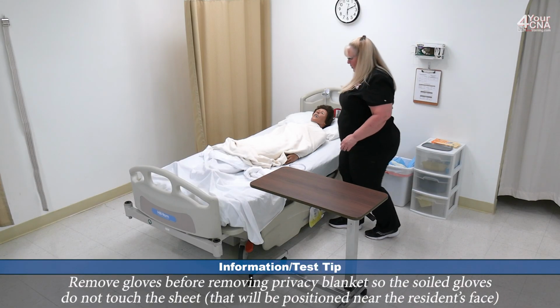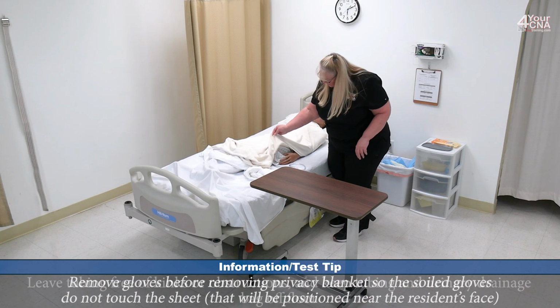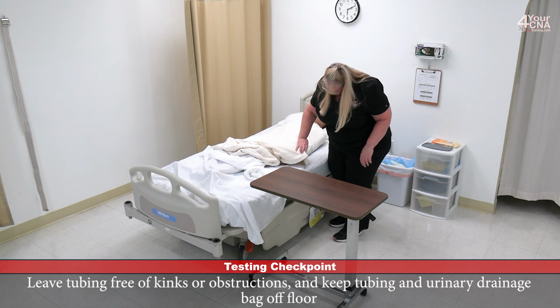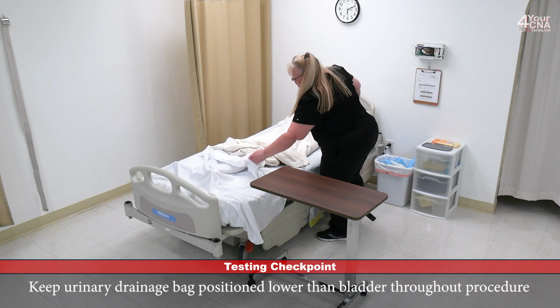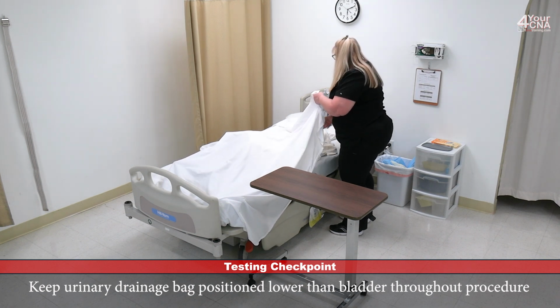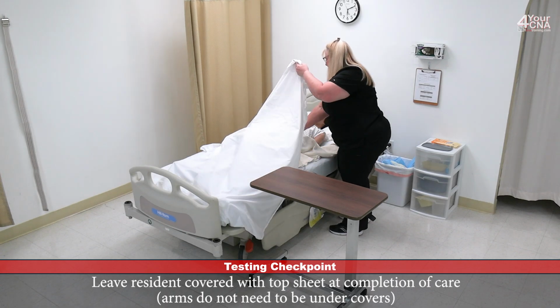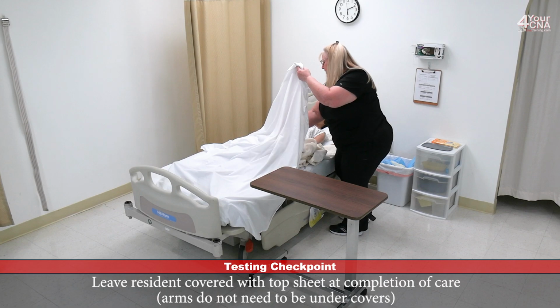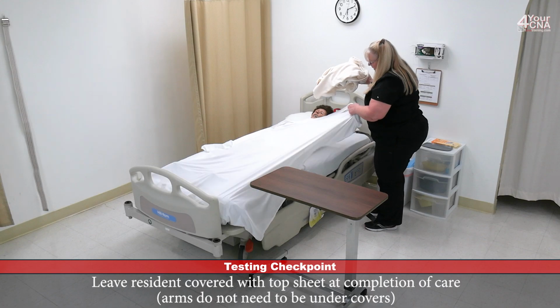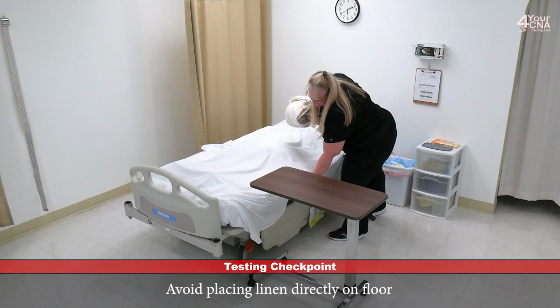Okay, Ms. Jones, I'm going to remove your privacy blanket now. I want to check your tubing real quick just to make sure that it's not kinked and you're not lying on it. So it looks good. It's not near the floor. So I'll pull the sheet up over the privacy blanket. This ensures that you're always covered. And I'll remove the blanket as I do so. Want to make sure that the blanket is rolled into a ball so trailing edges don't contaminate other surfaces.